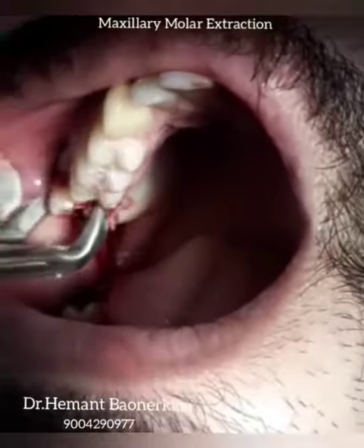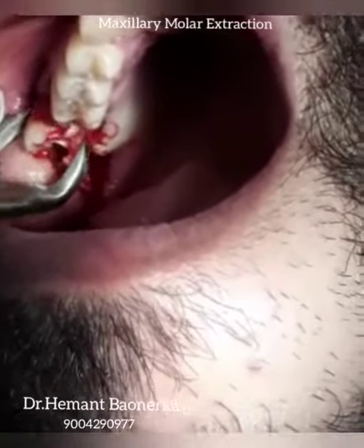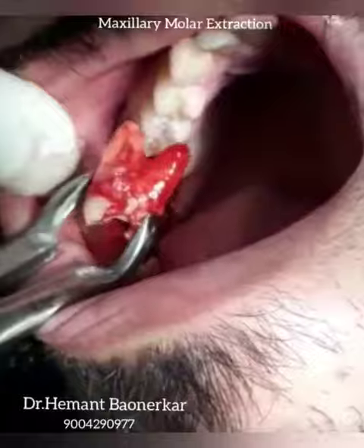Just rotate with a buccal motion to extract the tooth. Thank you.